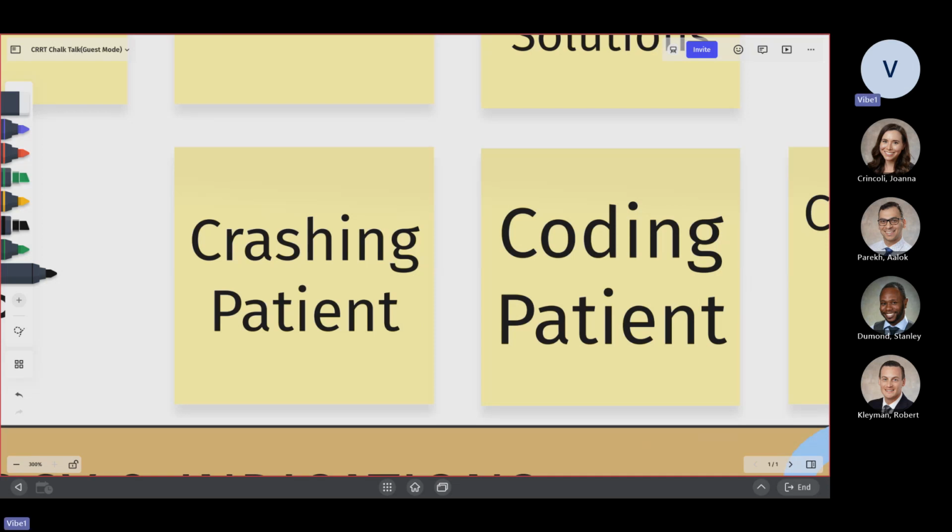So, final two things, unless anyone else has any questions. First is how to assess or deal with CRRT in a patient that you feel is about to crash. The patient has either ventilator asynchrony, concerning hemodynamics, or changes in mental status that are very acute.